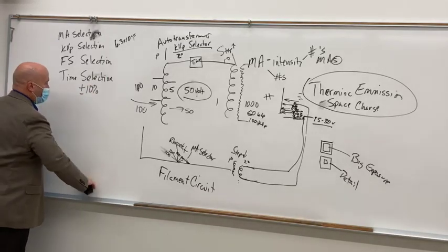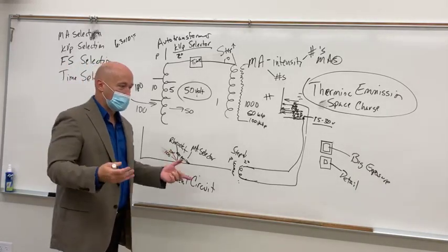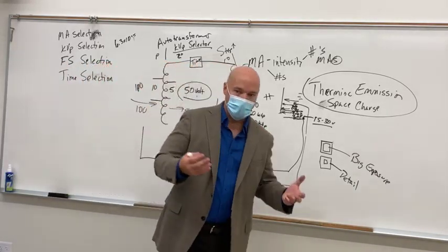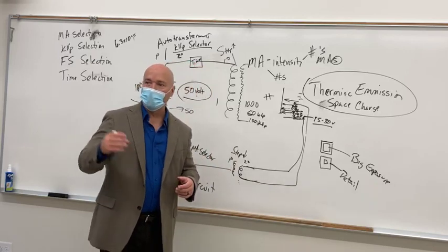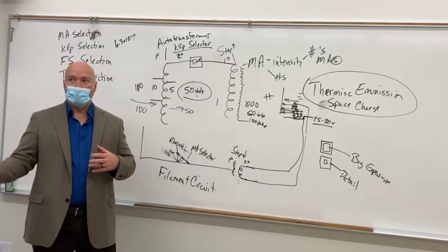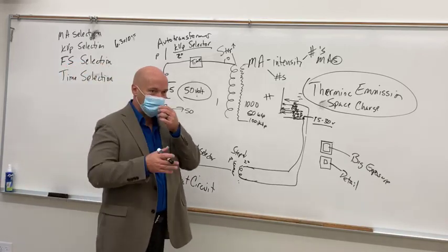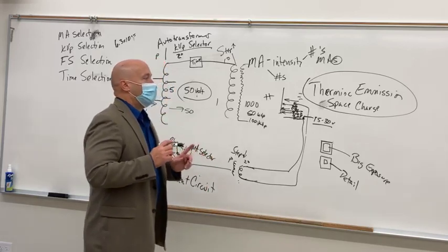Some are going to require you to set your time, so you set a technique. You're going to set your kVp, you're going to set your mA, you're going to set your time. Even if it's on a system that does it all for you, you're still doing all that through the system itself. So setting kVp, mA, and time.